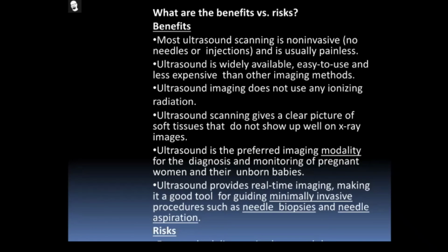Ultrasound is the preferred imaging modality for the diagnosis and monitoring of pregnant women and unborn babies. Most probably 100%, for pregnant ladies, if you want to monitor the fetus, ultrasound is suggested. Pregnant ladies are not supposed to be examined through X-ray, CT, or MRI. The only suggested scanning methodology is ultrasound, especially for pregnant ladies. And ultrasound provides a real-time image, making it a good tool for guiding minimally invasive procedures such as needle biopsies and needle aspirations. That is what you need to note about it.